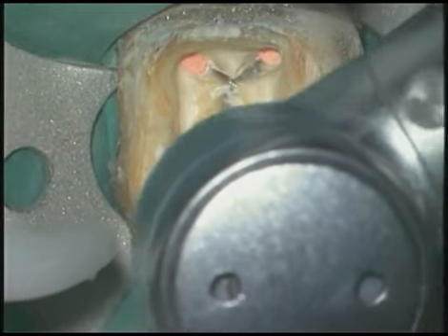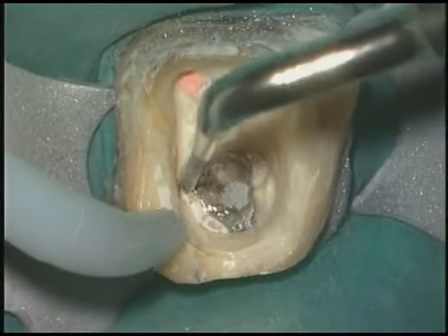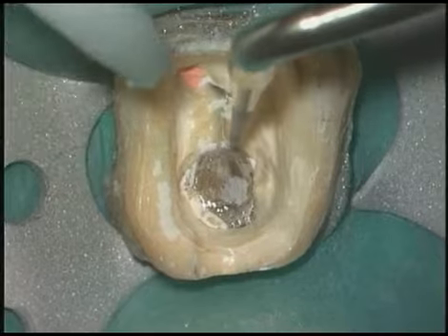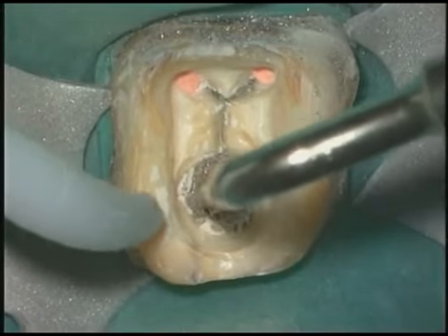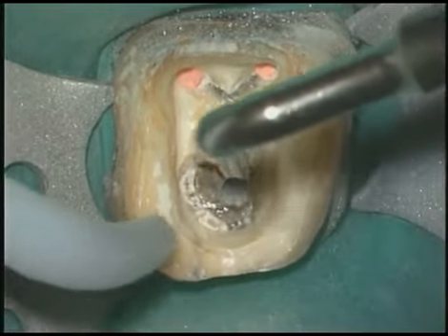The cast core must be reduced to facilitate post removal. A parallel-walled Pro Ultra number 4 can be used circumferential to the post to vibrate and break up cement. Use this instrument at the lowest power that will accomplish the clinical task. This instrument is carried lightly around the post. A brushing action breaks up cement.